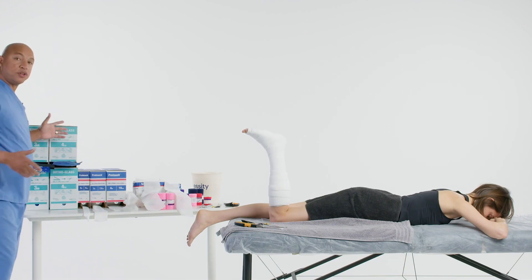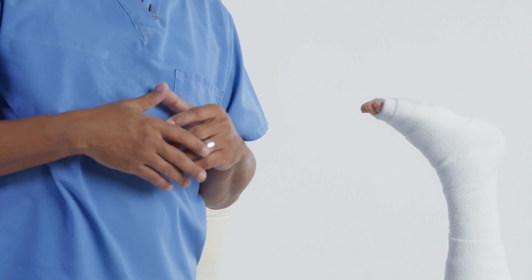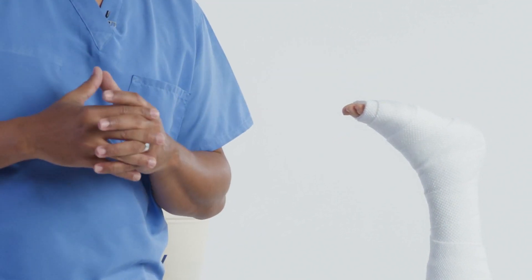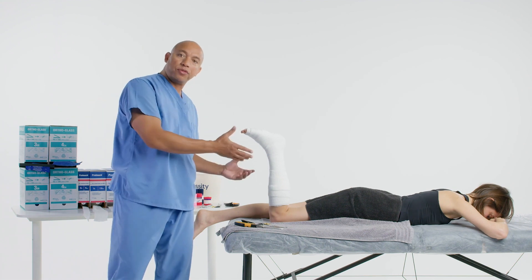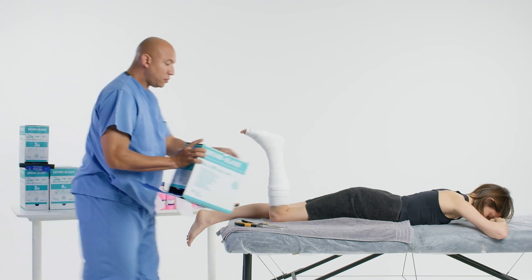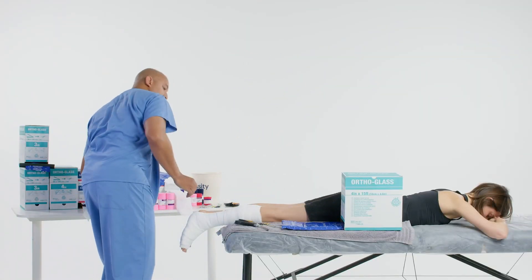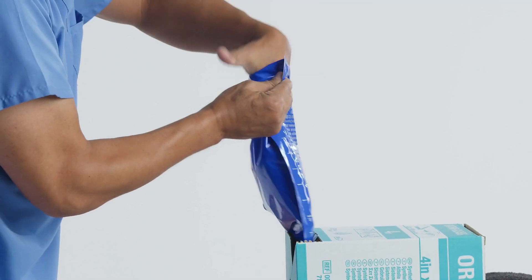Now let's cut the ortho glass — we'll cut the posterior slab first and then the stirrup. I have two different sizes available. Most of the time you want to use a four inch or five inch on most adults, and a three inch on small children. For the stirrup, be conscious that it doesn't totally encompass the extremity when you apply it, because then we have more of a circular closure almost like a cast, and remember the patient is going through the inflammation stage of the injury. Since this patient's extremity is a little smaller in diameter, I'm going to use a three inch for the stirrup.